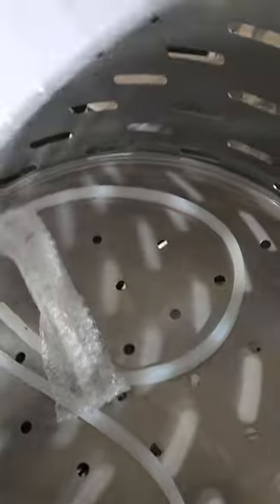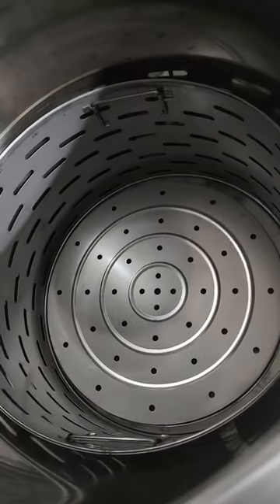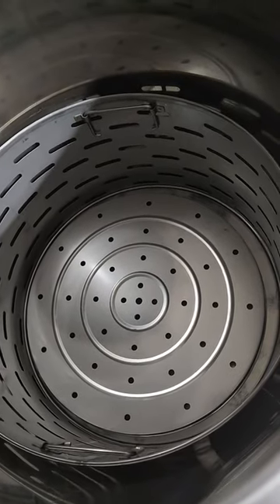Looks like we got some hoses. User's manual. Another basket down below, and your heating elements are below that.